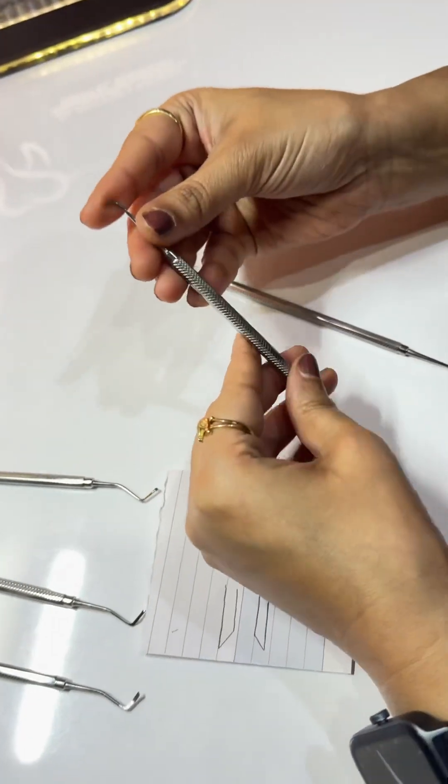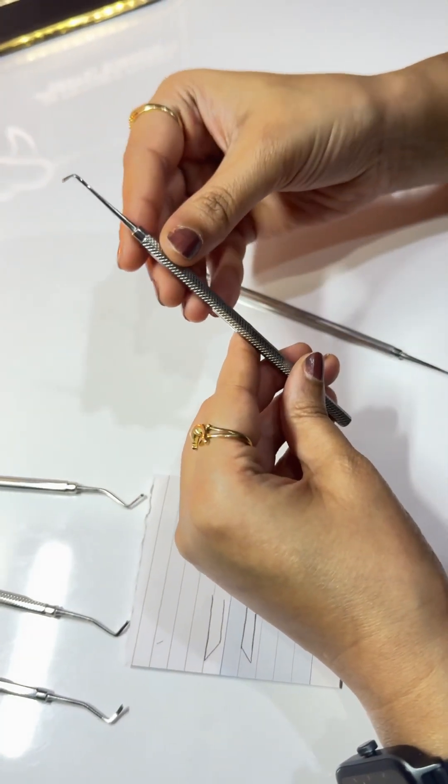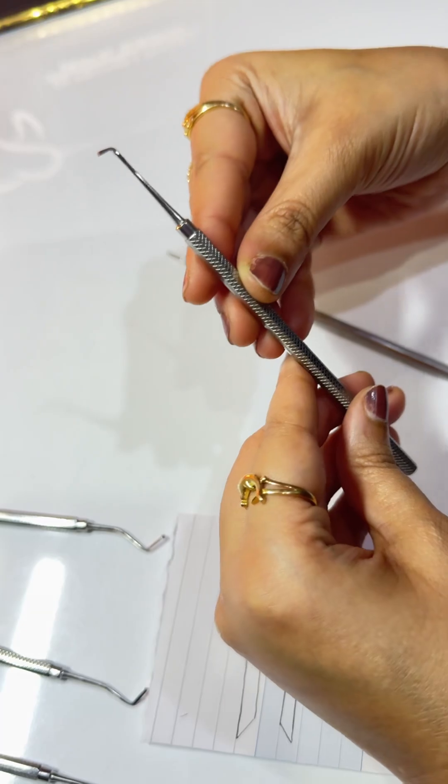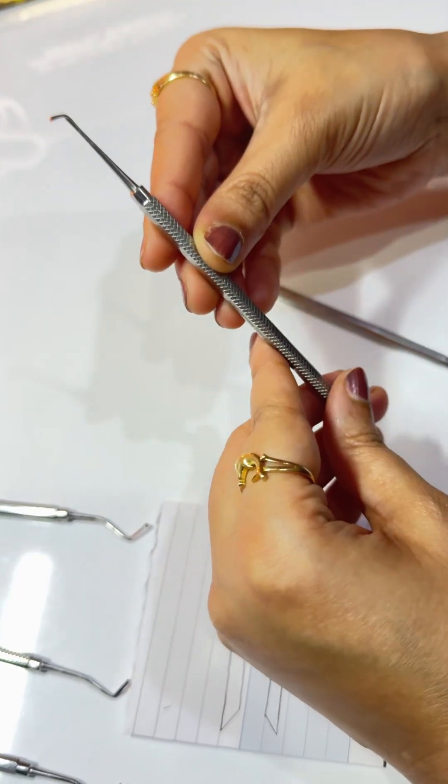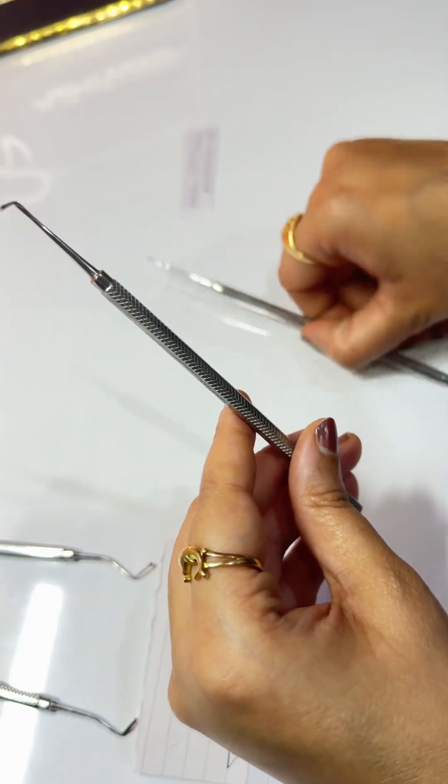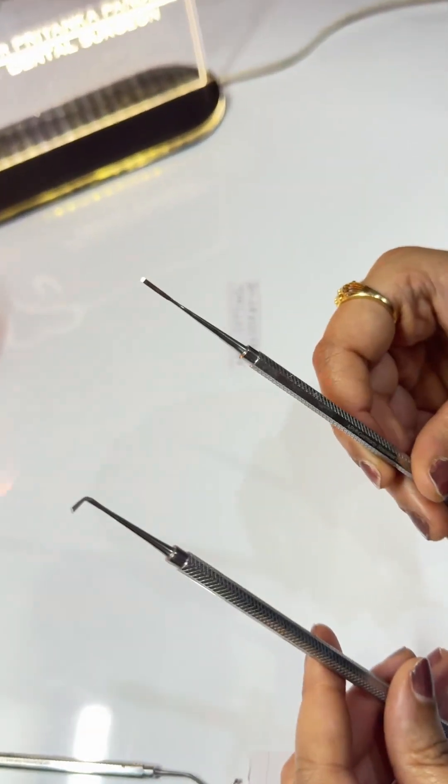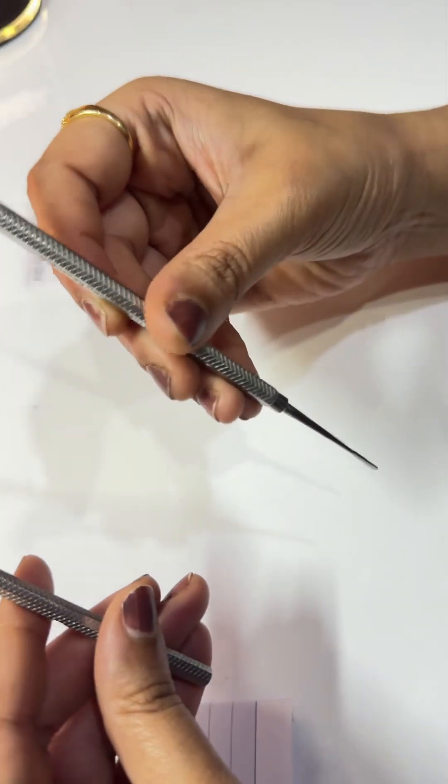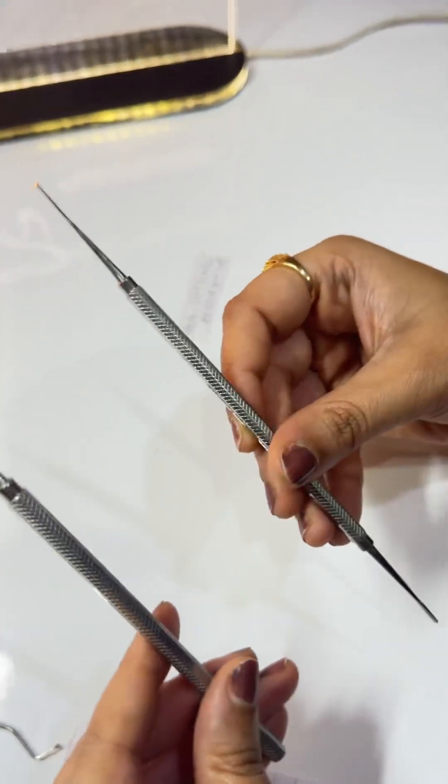The Ho is used in direct filling gold preparation and to define the line angles and point angles of class 3 and class 5 cavities. The chisel is used for cutting enamel and has a push stroke with lateral scraping action.